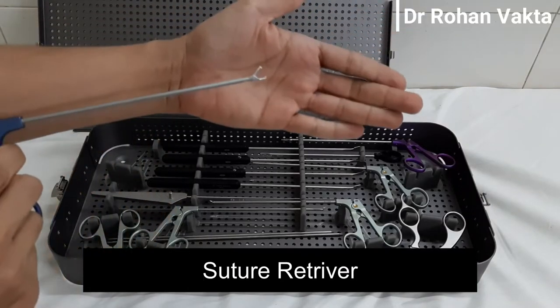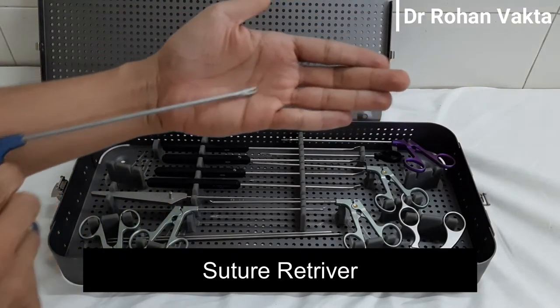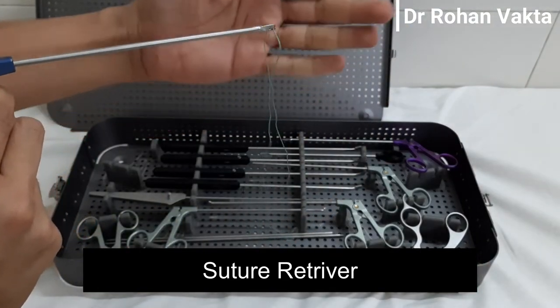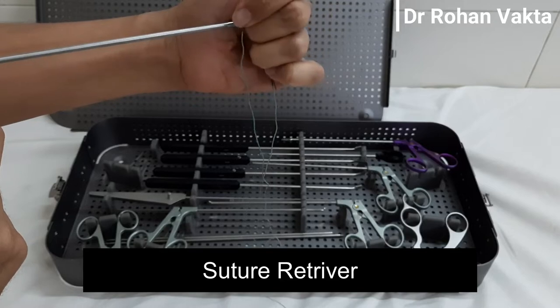This is the suture retriever. It is used for management of sutures in between the portals. The tip should be blunt so that while retrieving the suture, it should not damage the suture material.